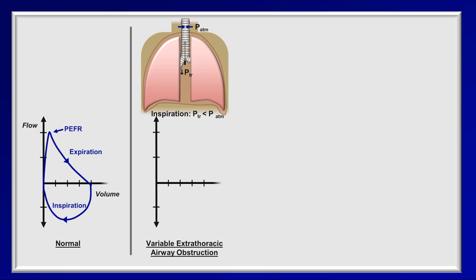This effect exists even in the absence of an obstruction, but the additional narrowing only becomes flow limiting in the presence of pre-existing obstruction. As you can see in the flow volume loop, the expiratory limb is normal, while the inspiratory limb is blunted.